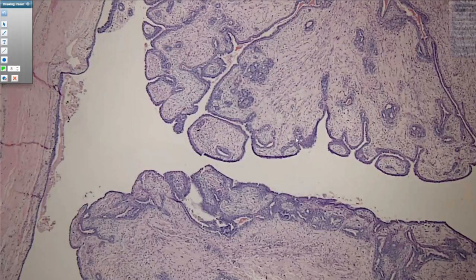And in many cases of phyllodes tumors, we have the diagnostic features on the H&E. It's when it's purely spindled or you're handling a small sample size on a core biopsy that immunostains may be needed, or the differential or the diagnosis may be equivocal.